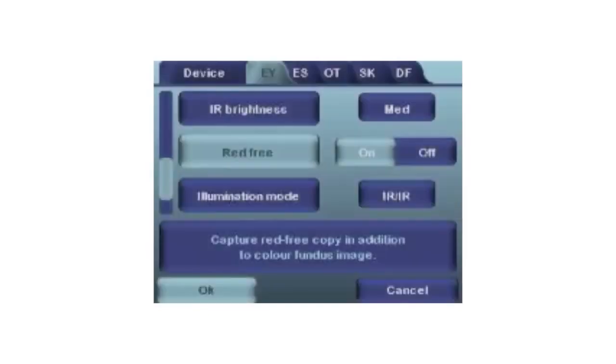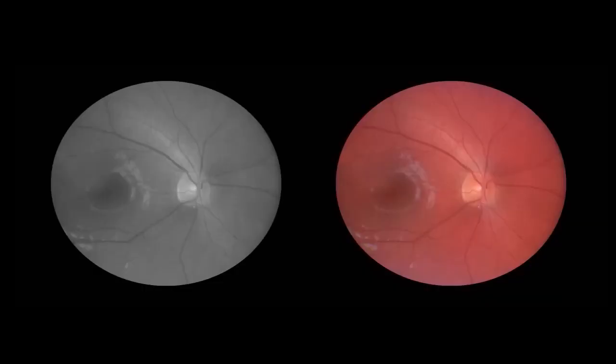With SmartScope, it is possible to capture red free images using the green channel. This is enabled in the EY menu. When activated, the camera will save two images for every picture taken: a red free image in addition to a standard color image.